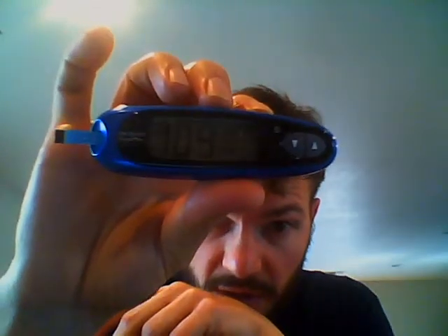Here we go — 109. Blood sugar 109, one hour after a fruit smoothie. Excellent! I feel great.